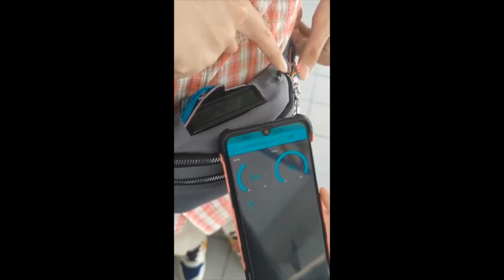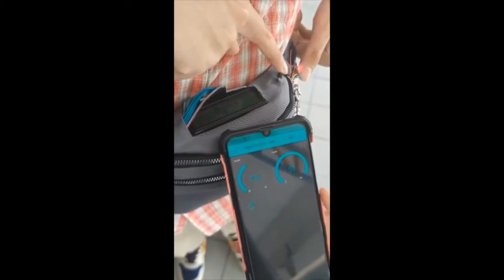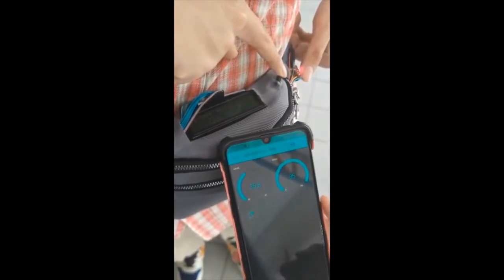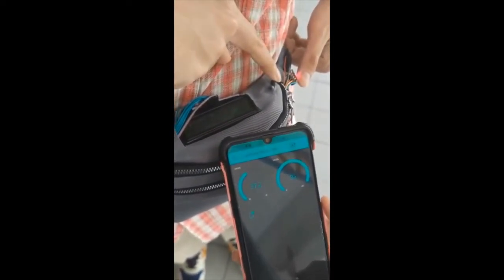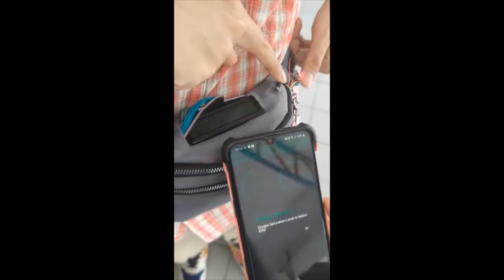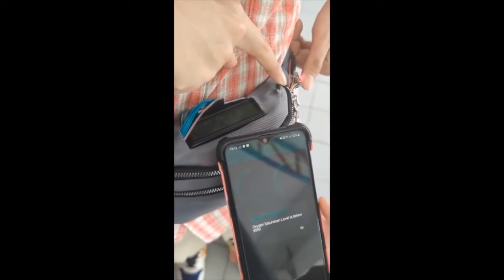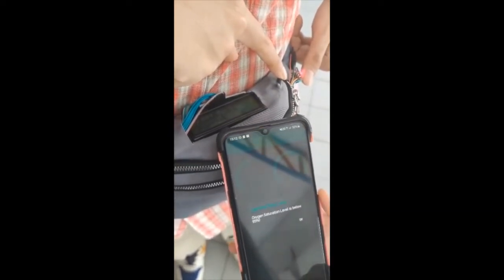We will see what happens when blood oxygen concentration value is lower than 95%. We can see the notification is being displayed.